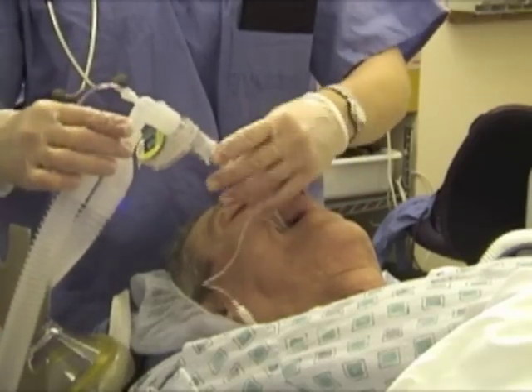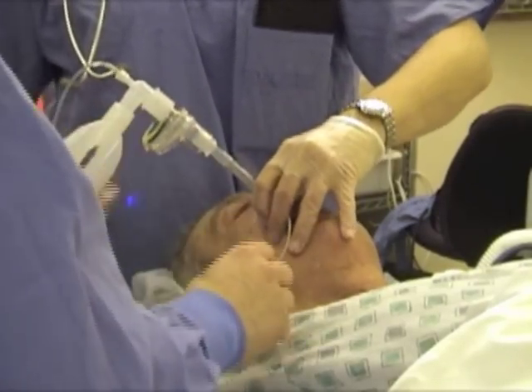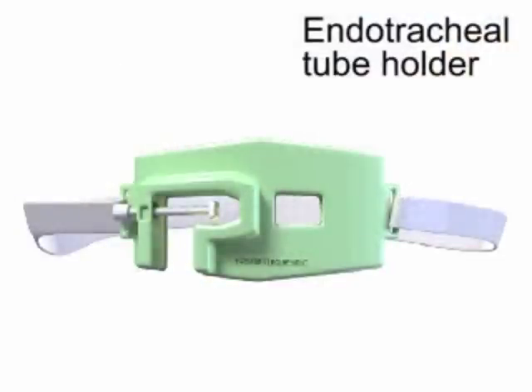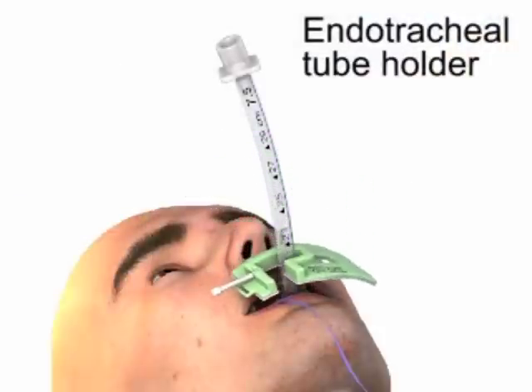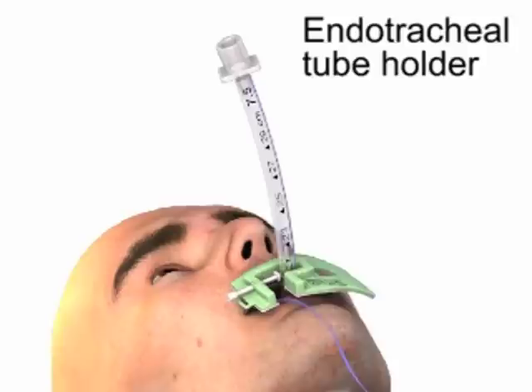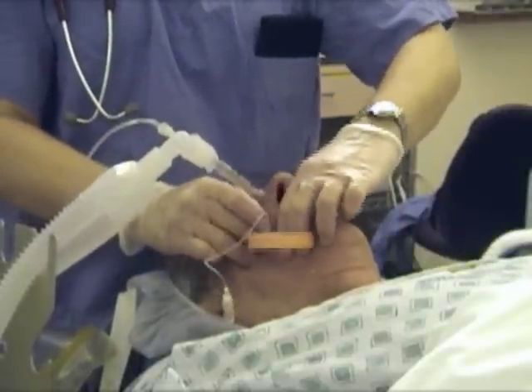Secure the endotracheal tube to the patient's head once proper position has been confirmed. If available, you should use an endotracheal tube holder to secure the tube, as these devices aid in the prevention of accidental displacement. If such a device is not available, tape may be used instead.